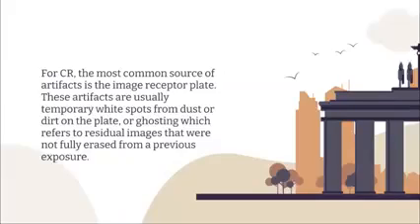For CR, the most common source of artifacts is the image receptor plate. So that is the IP, imaging plate. These artifacts are usually temporary white spots. Yes, from dust or dirt on the plate. So as I have said also in artifacts from film screen system, when your image receptor is dirty, specifically the screens, it will produce white spots. Okay? Or ghosting, which refers to residual images that were not fully erased from a previous exposure.